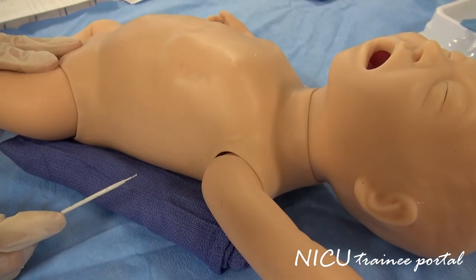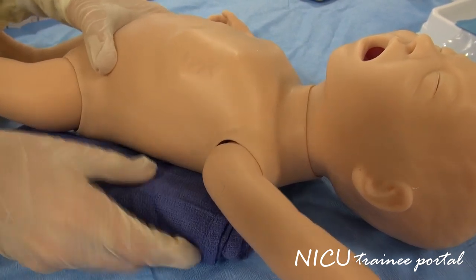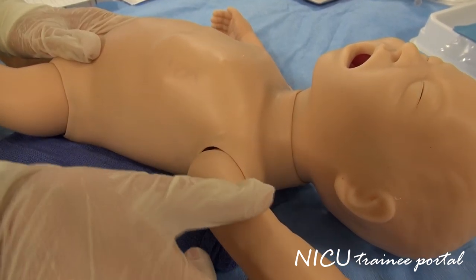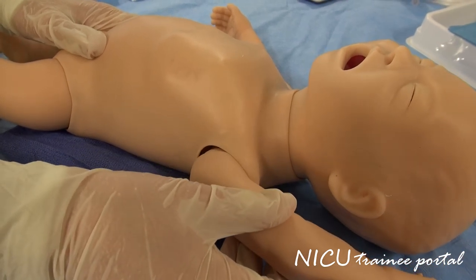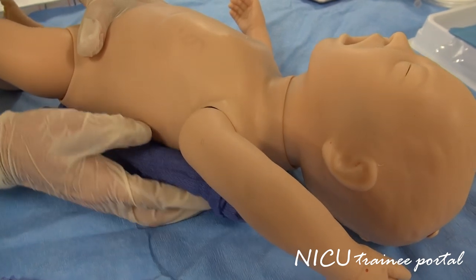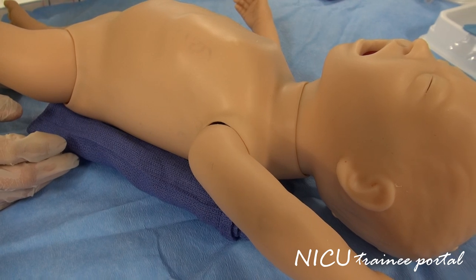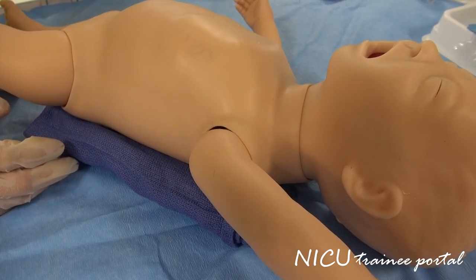It's important to position the baby appropriately before starting any procedure. Assuming this infant has a left-sided tension pneumothorax, you will want to place the arm above the head and secure it, and use a roll to appropriately position. Pre-medicate with morphine or fentanyl, and ensure that you obtain parental consent if it's a non-emergent procedure.